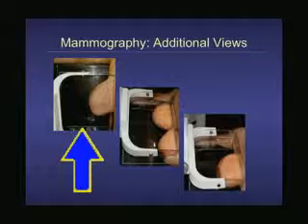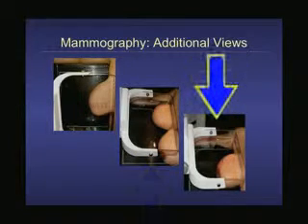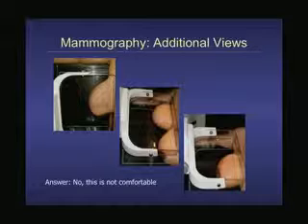Now we can do lots of other positions. This would be a true lateral. This is called the cleavage view. That's pretty self-explanatory. And this is the Cleopatra view, and it's supposed to simulate Cleopatra kind of relaxing down the Nile. And I know the first question everybody's going to ask, so I'll answer that right now. No, this is not comfortable. It's not painful, but it's not comfortable.